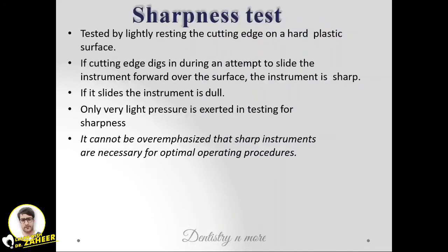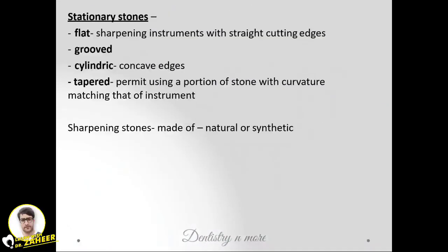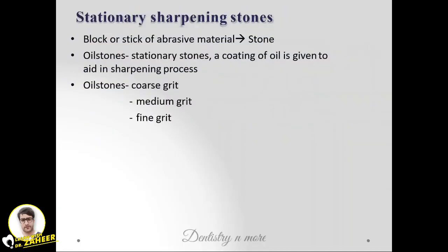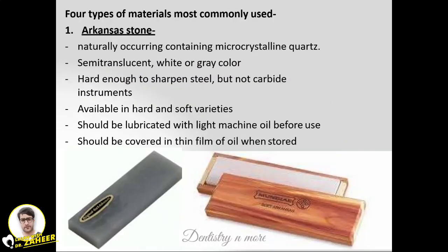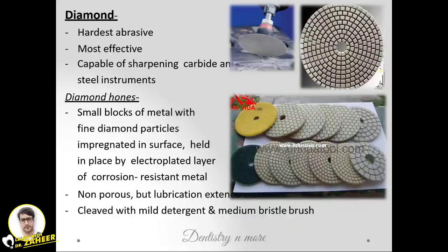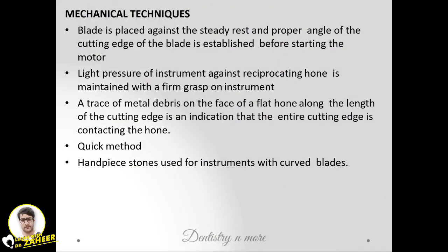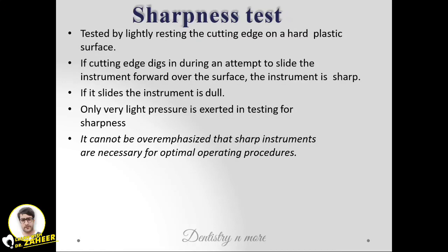So that was all about sharpening. We learned about the sharpening instruments, sharpening stones, mechanical sharpeners and handpiece sharpening stones. We have stationary ones, basically four types: Arkansas, silicon carbide, aluminum oxide and diamond. And we have mechanical sharpeners, principles of sharpening, stationary techniques, and finally the sharpness test.